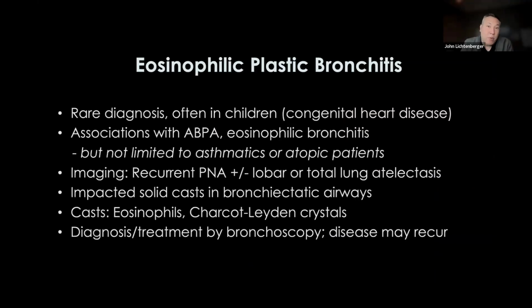Only a few cases have been reported. But as a practicing clinical radiologist, what I would take away is to pay attention to the airways for bronchiectasis, which tells you that while they may have a pneumonia, they also have something chronic going on that may be leading to a recurrent pneumonia. And then I would take a second look at things filling the airways. In those cases of chronic airways disease and pneumonia, I would look for things filling the airway that would lead them more toward a bronchoscopy, in which case they would make this diagnosis of eosinophilic plastic bronchitis.